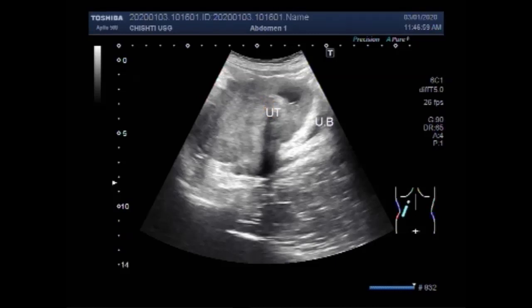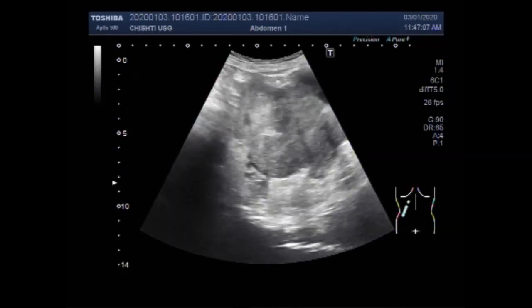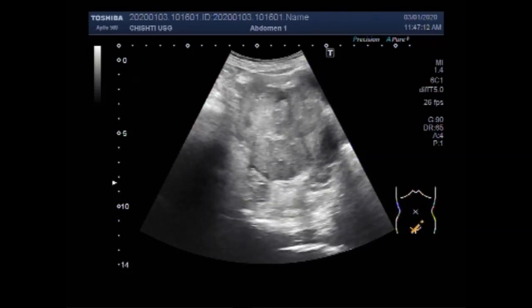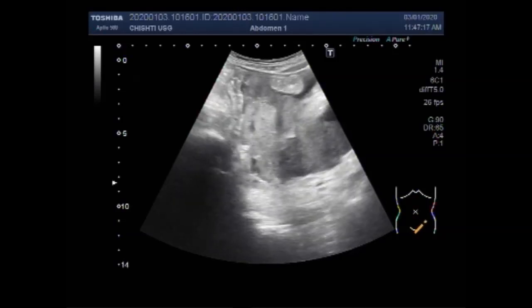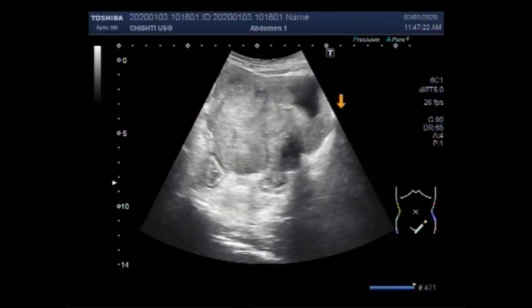This is the uterus and this is the cervix. The mass is seen in the left ovary, encircling some portion — the distal portion of the uterus. The uterus is involved in this mass and is incorporated in this large left ovarian mass.